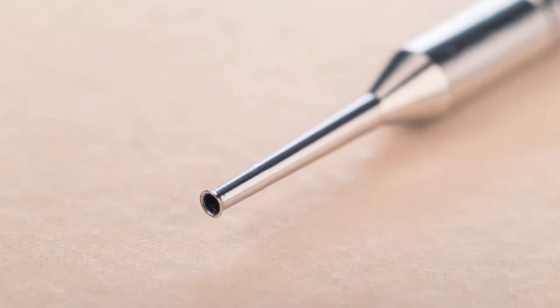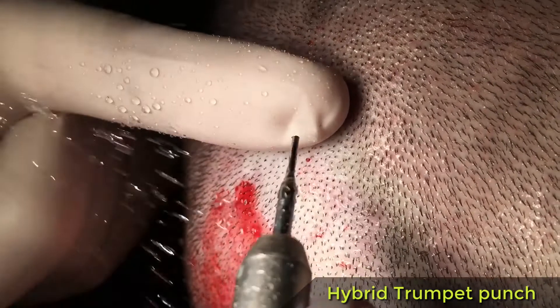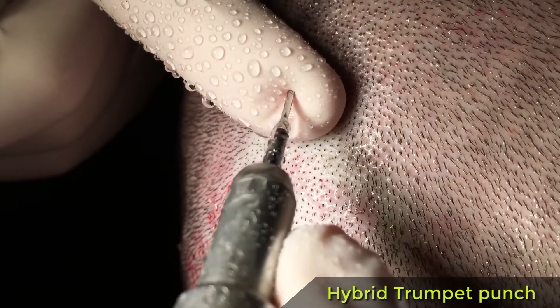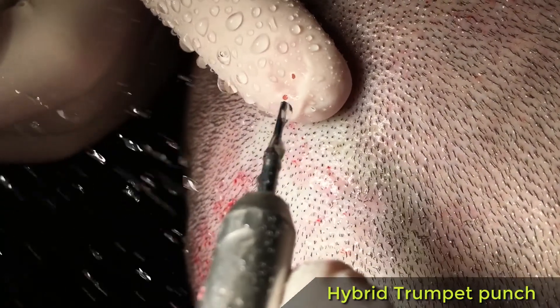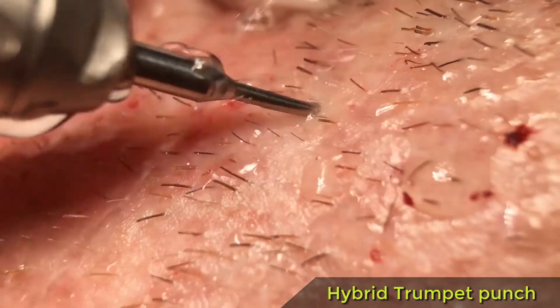The punch's main characteristic is a cutting edge perpendicular to the axis of the punch — the principle is completely different from that of a sharp punch. With the hybrid trumpet punch, the surgeon must apply some pressure so that the skin undergoes a round deformity into which the punch will fit. The sharp 90-degree edge will then cut the skin almost as easily as a sharp punch does.